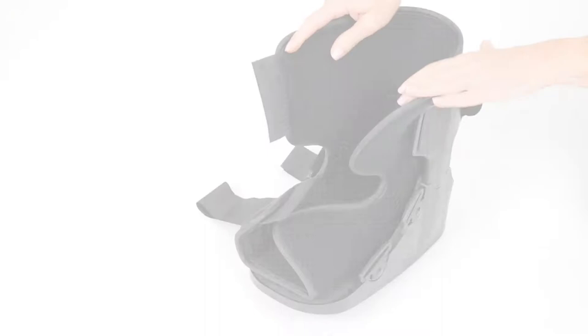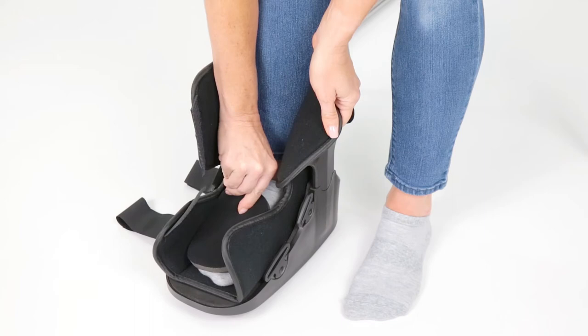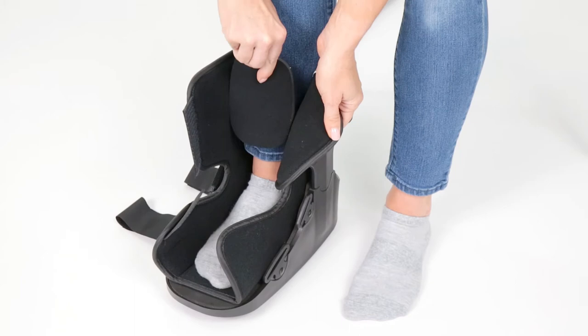Secure your foot inside the boot. For extra comfort, additional padding can be placed on the top of the foot, on the ankle, or placed on the shin.